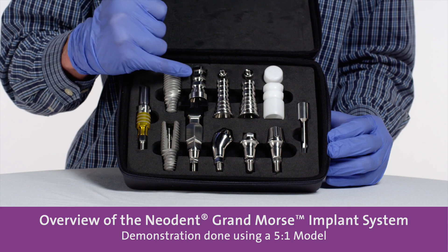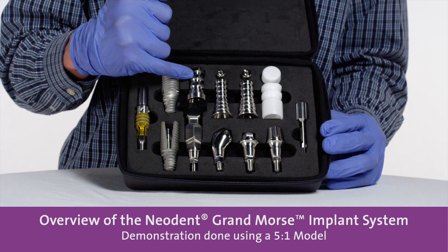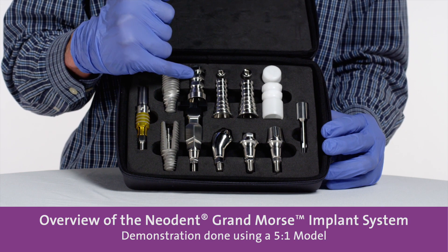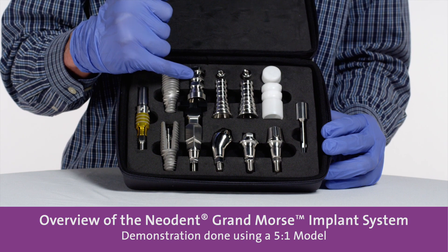We have here a coping that can be used as an open tray impression coping for the mini conical abutment, and it can also be used as a temporary coping.